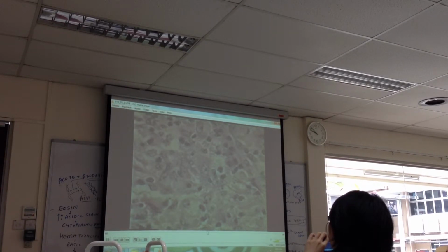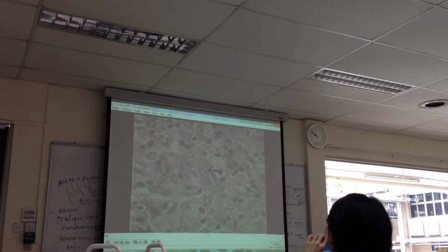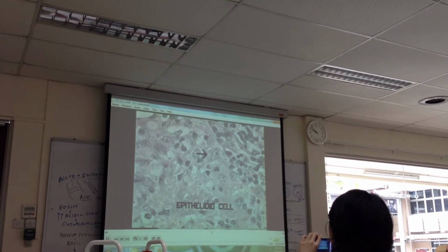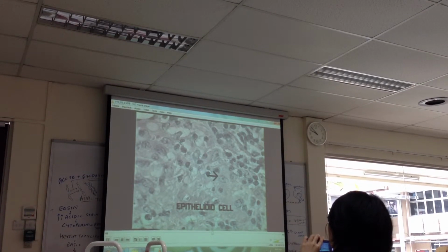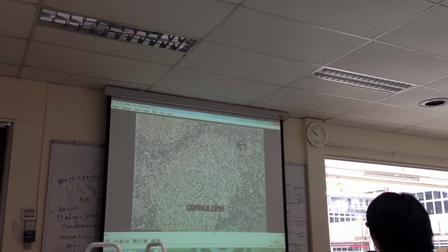In many types of chronic inflammation, macrophages are unable to destroy the causative agent. The macrophage may then develop an elongated pale nucleus and eosinophilic cytoplasm. Such a macrophage is called an epithelioid cell. It attempts to sequester the toxic agent by becoming less motile and less phagocytic and developing a secretory function. A collection of epithelioid cells is a granuloma.